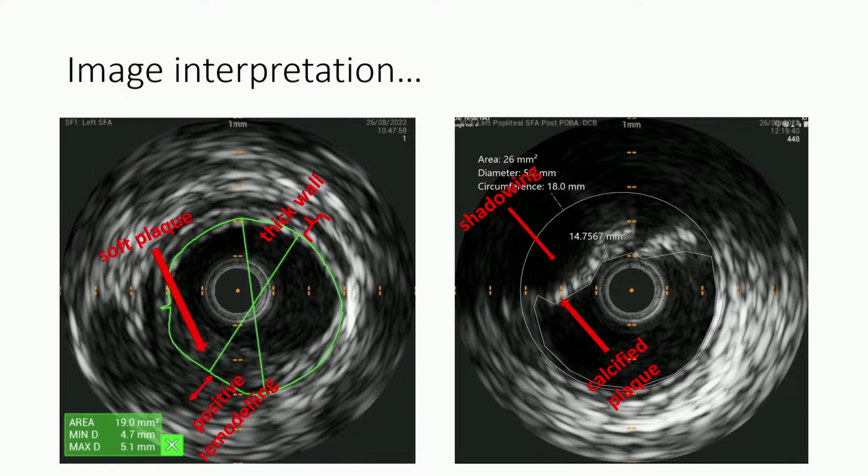All you can see is the first layer of calcium, and then almost all of your ultrasound waves are bounced back, and you're looking for a window or gap between calcium where you can maybe get out a velocity measurement. But if you're looking from inside the artery, suddenly you can see much more about the plaque that's actually going to be the first thing that contacts any of the devices that you're using to treat.